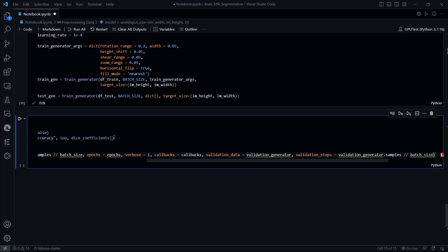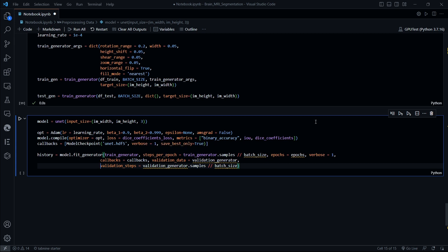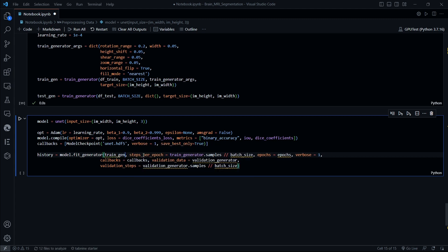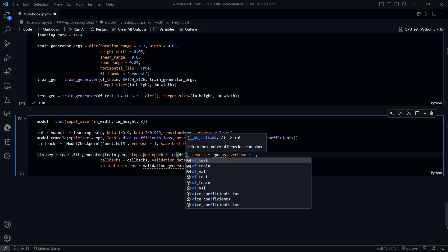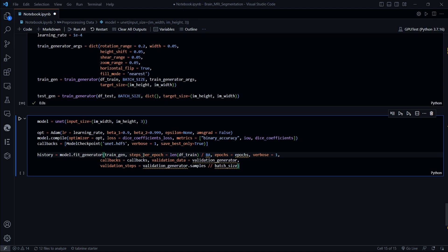Now we are going to pass train_gen into the fit function, then steps_per_epoch would be the length of df_train divided by batch size. Epochs should be the epochs variable, and verbose is not necessary right now.